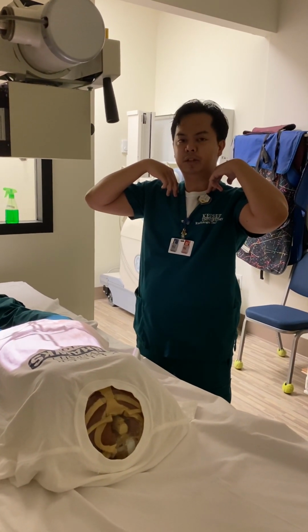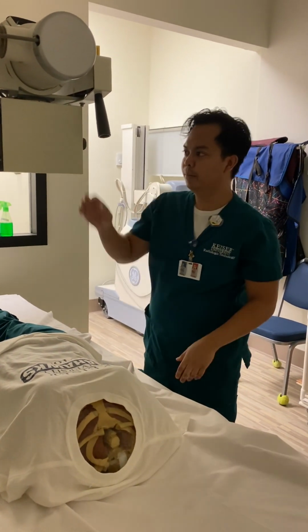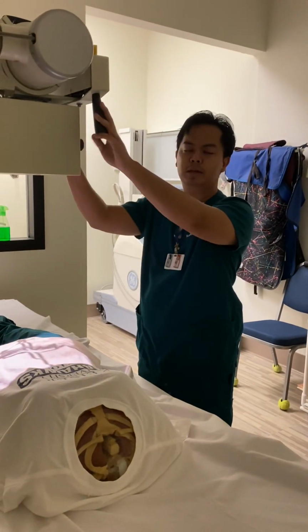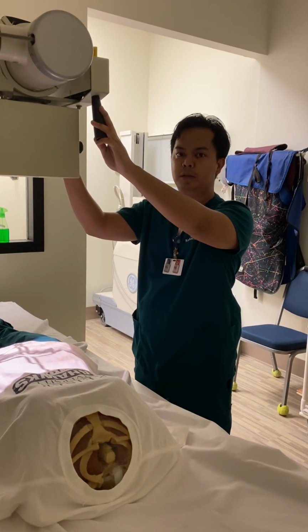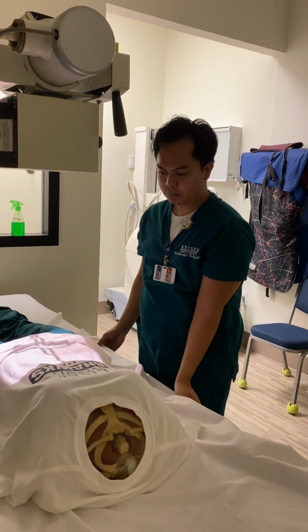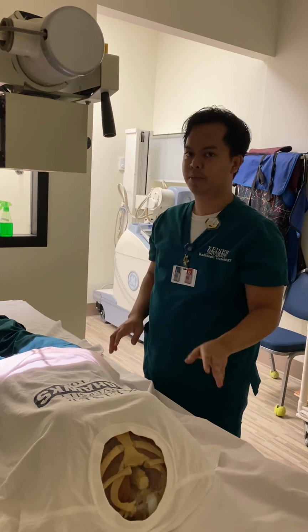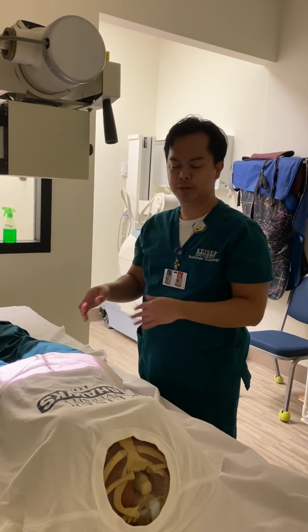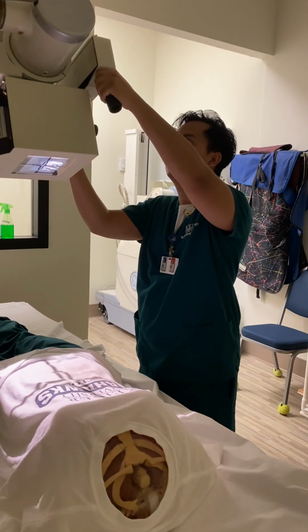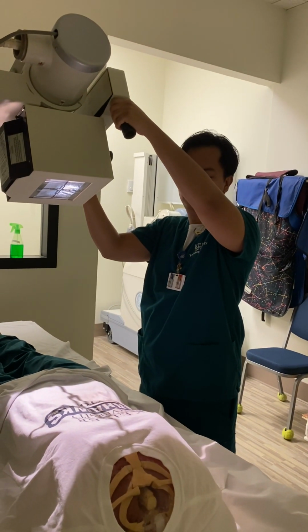and you're able to see the apices of the lungs, if they have any opacification or any sort of disease going on underneath that. But we can't do that with this non-ambulatory patient, so we'll have to angle this up to 25 degrees cephalic. So have the patient a little bit up so your light won't get into their eyes. Just to estimate, I'll position and I'll do the centering later on. So have the angle up to around 25 degrees.